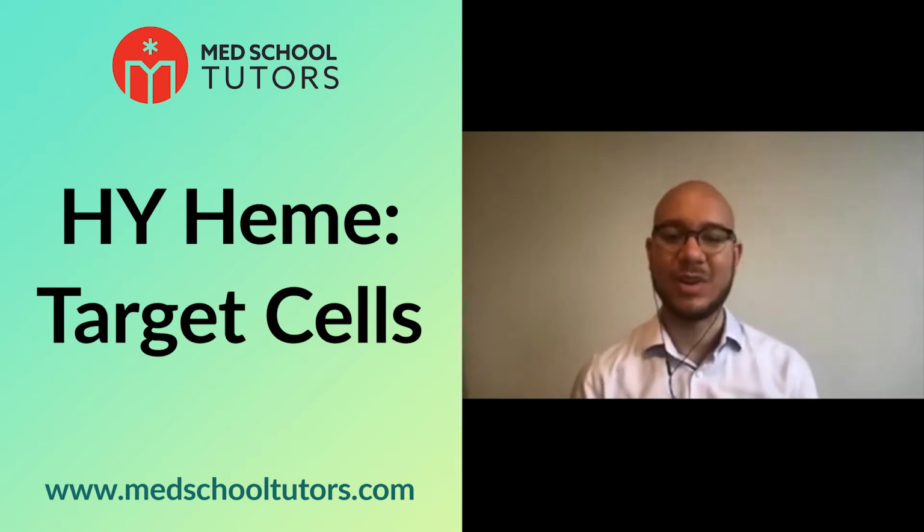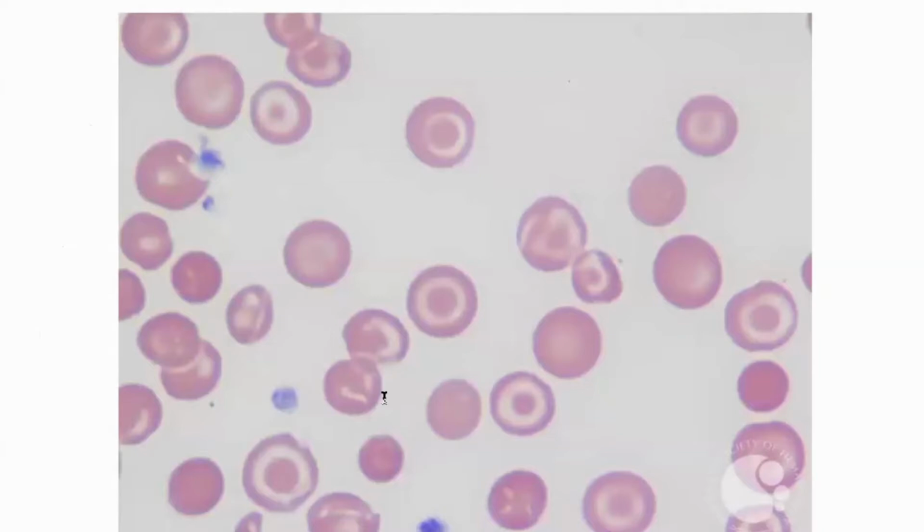Here's the next one, very classic image. And the chat is all over this, beautiful. So a lot of folks are saying target cells, that's exactly right. Now what I would love to see in the chat is, what are some diseases that would lead to this particular presentation? So we've identified target cells.